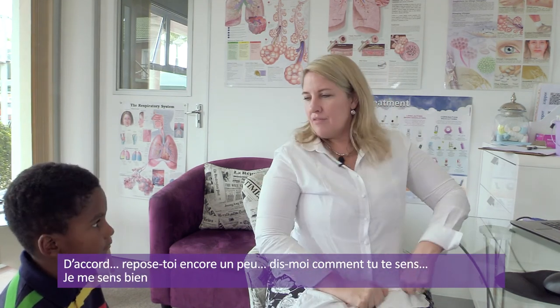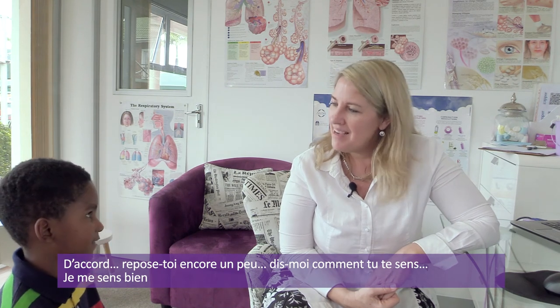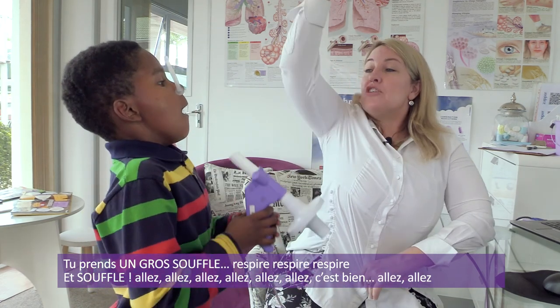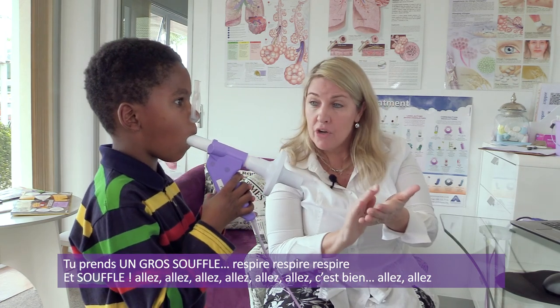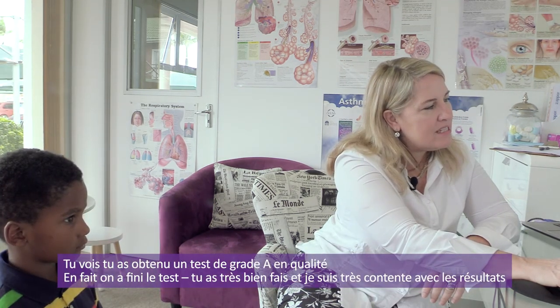Good. Okay, just sit for a moment and tell me, how are you feeling? I'm feeling all right. Ready to do another one? All right, good. Okay, take a deep breath in. Fast as you can. Go, go, go, go. It's very good. And breathe in fast. Breathe in, breathe in. And rest. That one was beautiful. Really, really well done. You see, you've got a quality grade A test.